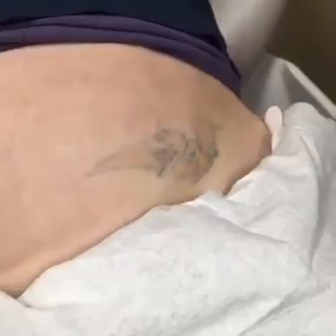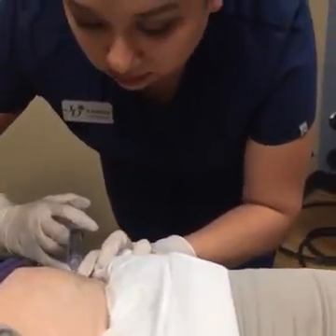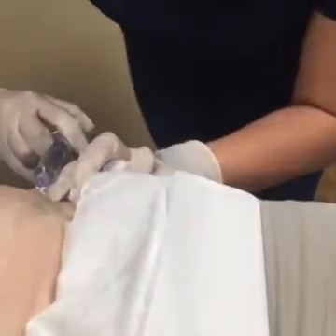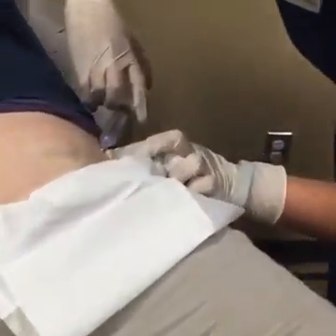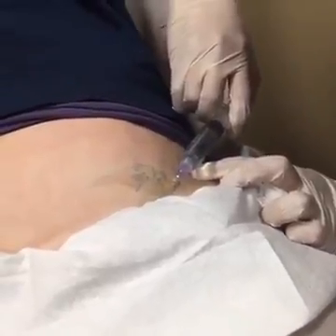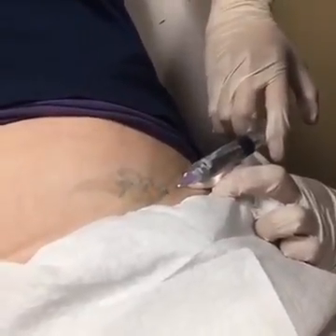The first step of doing this is going to be to get it numb to make it a painless procedure. So we'll let Alondra go ahead and start getting this numb. Alondra is one of our laser technicians that does the actual lasering for us. And Bridget is our assistant cosmetic coordinator that also does some of our lasering, that's going to be talking about this with us today. She has had one treatment, and as you guys can see, she already has excellent results. So Bridget, why don't you tell us about how many treatments to expect with the laser tattoo removal?